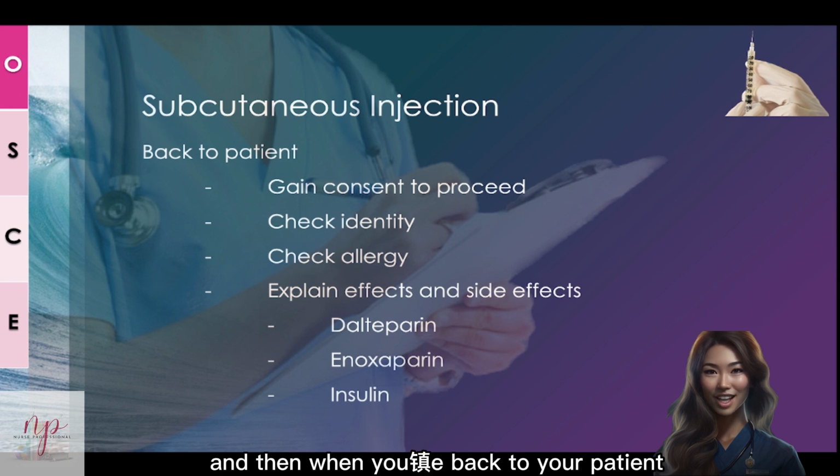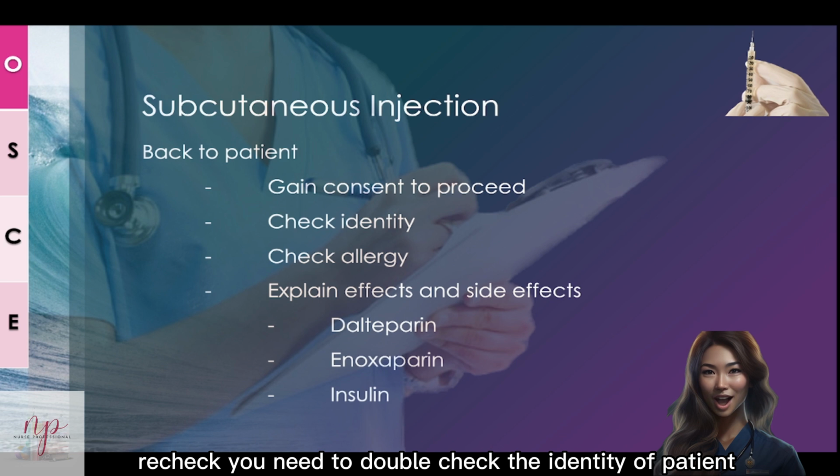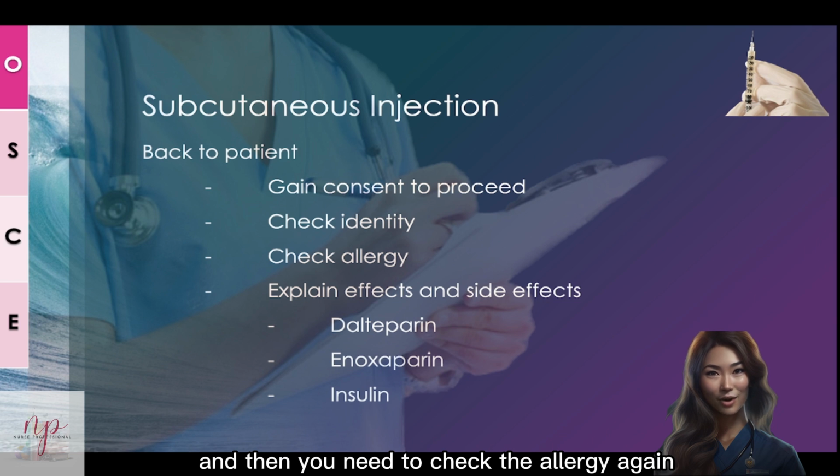And then when you're back to your patient, you gain the consent to proceed, and also as you've left your patient for a while, make sure you recheck. You need to double check the identity of the patient. We don't want any medication error. And then you need to check the allergy again.